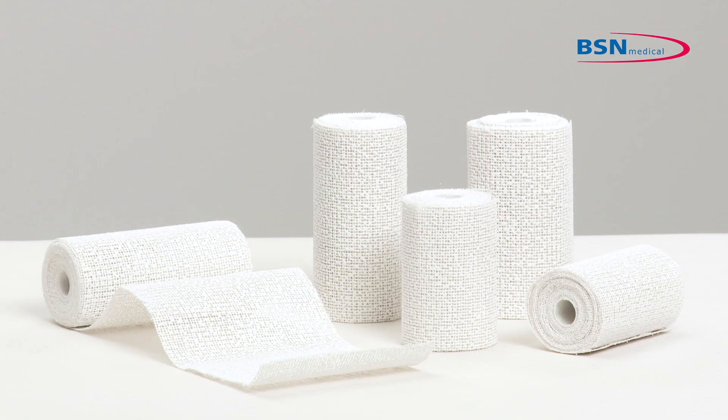For indications where immobilization of the wrist and elbow is required, for example, fractures of the elbow joint or short arm.